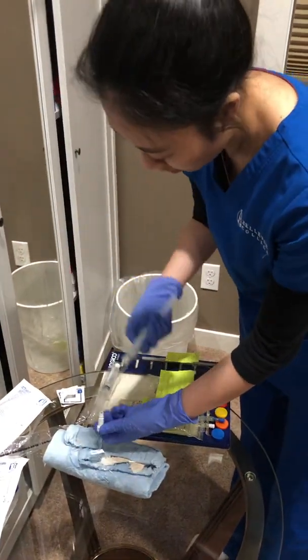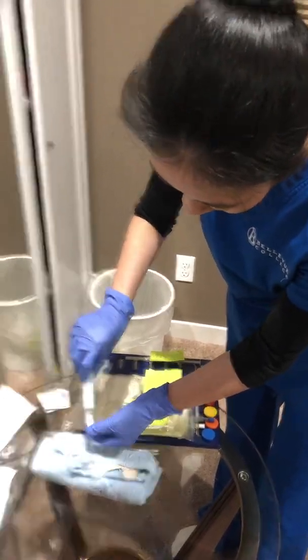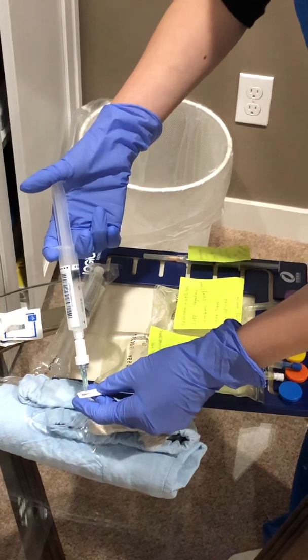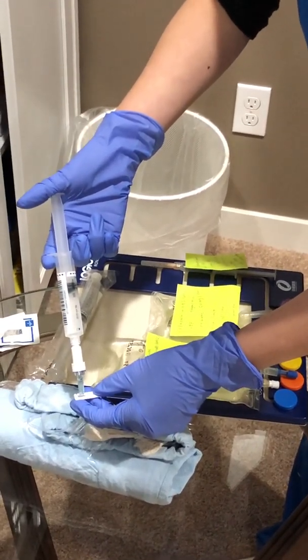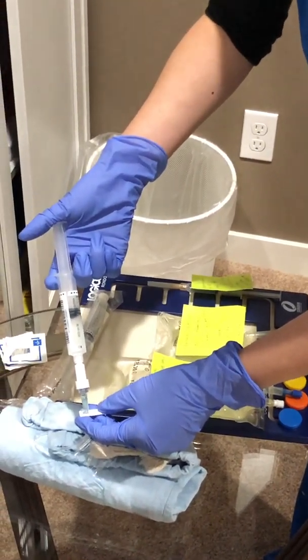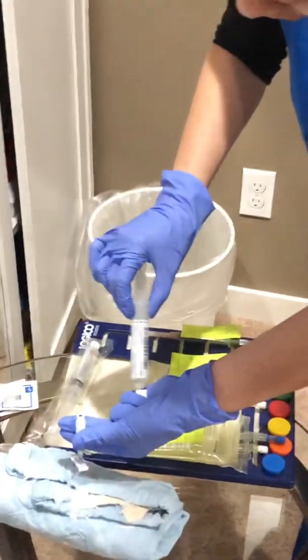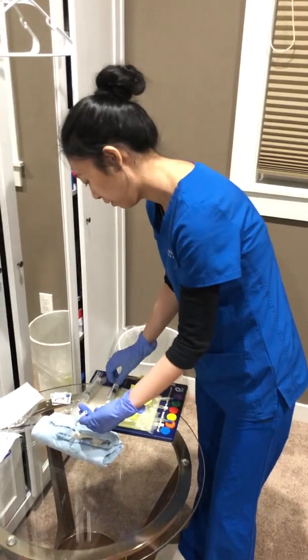Normal saline. It's already dry. Sterile to sterile. Okay. Then I'm going to push it slowly. Make sure I give you more than 5 milliliters. Okay, lock it. Good. Your IV site looks very good. No blood clot. It's patent.